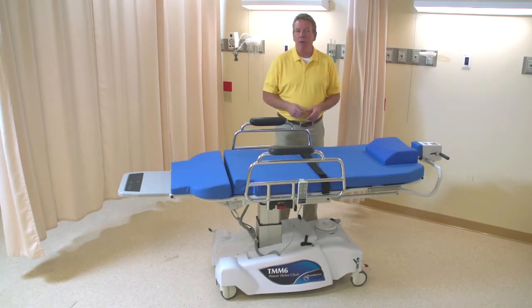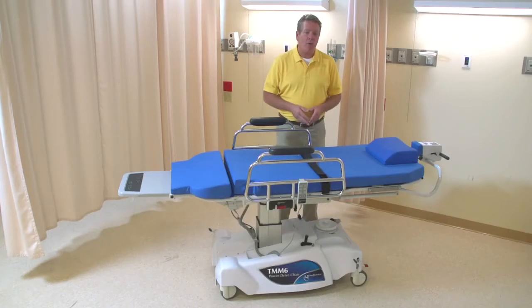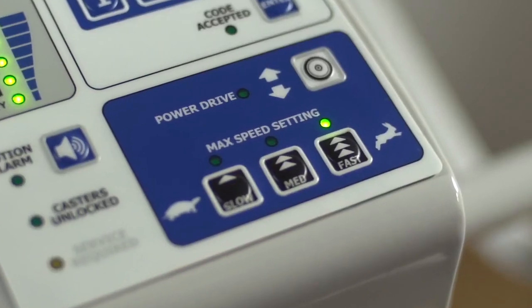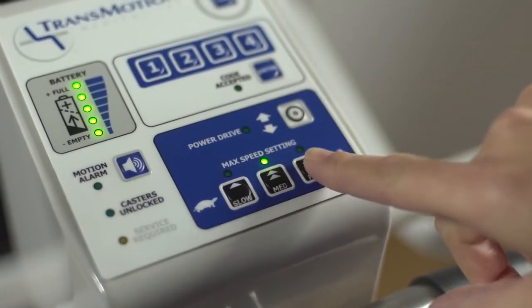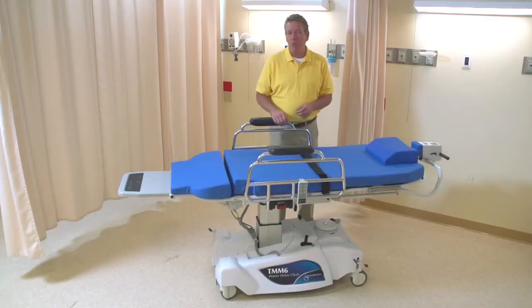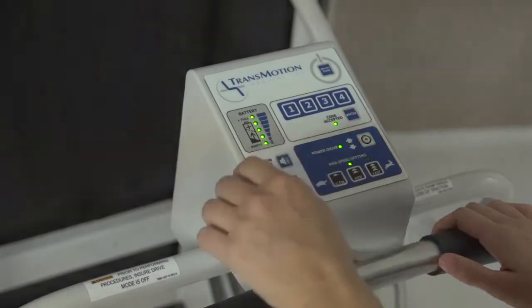Next, check the user interface for the status of the power drive. If the indicator light is glowing, this means the power drive wheels are down, in contact with the floor. There are maximum speed levels, indicated by lights on the user interface. Push the slow and fast buttons to adjust the maximum speed to a comfortable walking gait. And decide whether to engage the motion alarm.